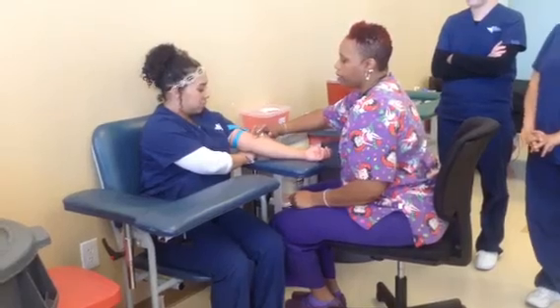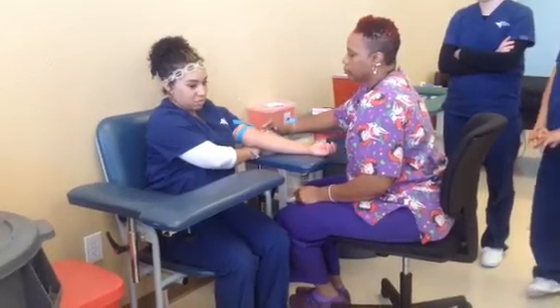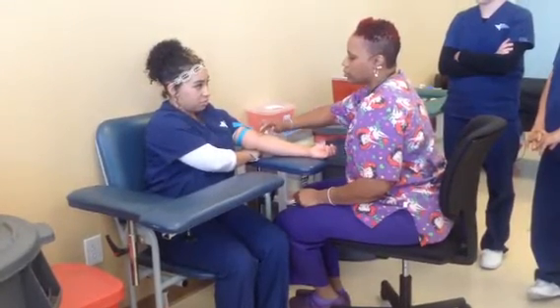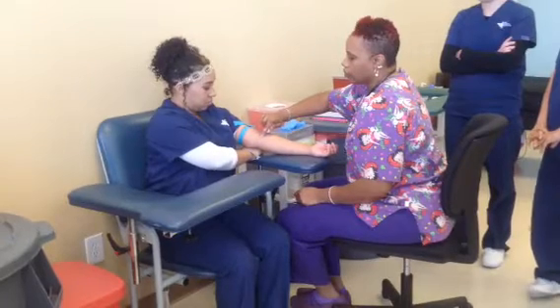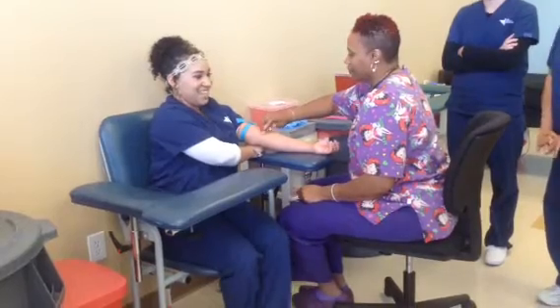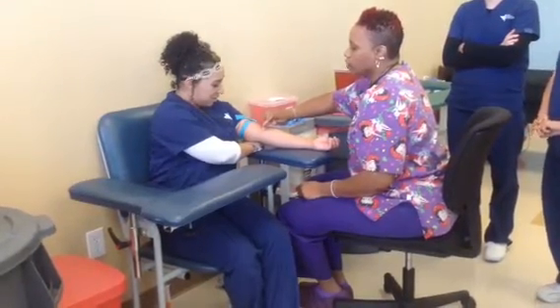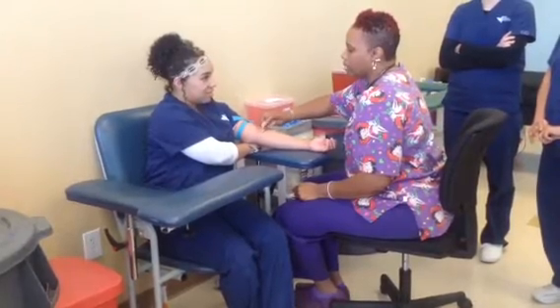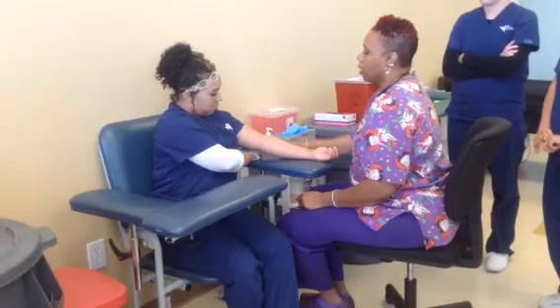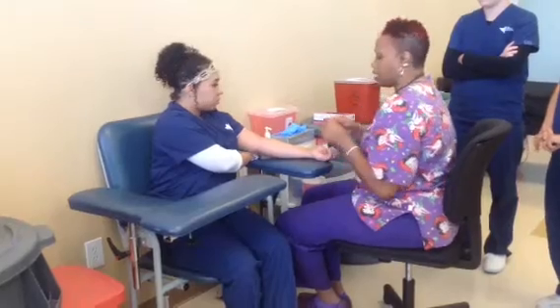Then I'm going to go ahead and palpate. She has a median. She has a cephalic, but it doesn't feel as good as a median. She has a fabulous basilic. As a phlebotomist, we always want to stick what feels good to us, so I'm actually going to stick her basilic vein. Remember, tourniquet time is a minute or less, so I'm going to go ahead and release that.